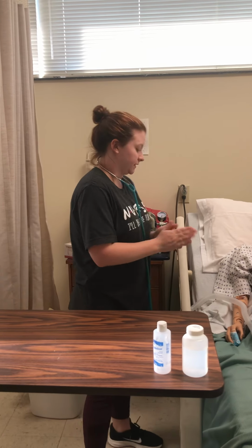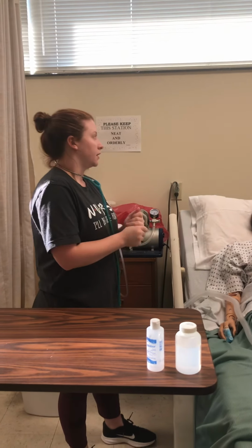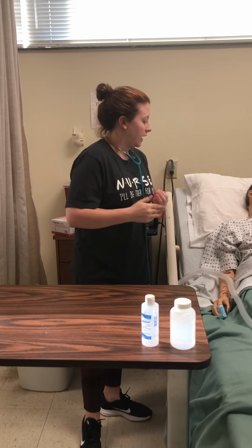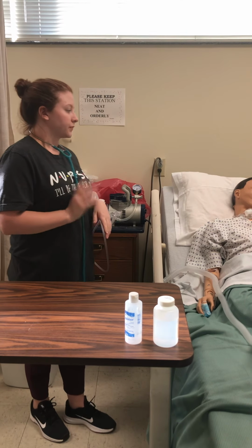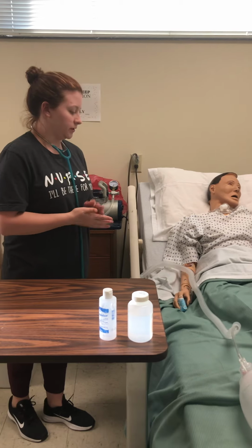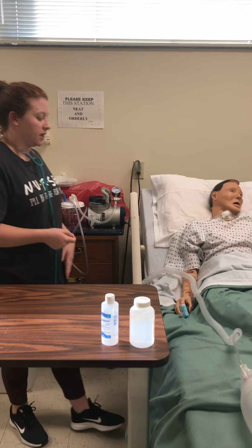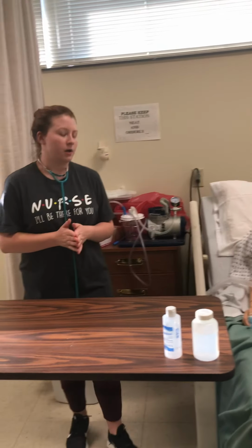And I'm going to assess my patient. He seems to be breathing better. His O2 sats are still up at 95%, and he doesn't have any requests at this time. The bed rails are up. The bed is in lowest position. The bed is locked, and he has his call bell in reach. And now I'm going to document.